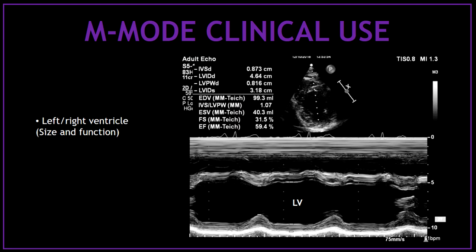You can also use the M-mode to measure the left and right ventricular size and wall thickness in diastole and systole. The most common views to do this are the parasternal long axis view and the parasternal short axis view at the papillary muscle level. By using the M-mode to measure the left ventricular size in diastole and systole, you are also estimating the ejection fraction by the Teichholz method, and therefore assessing the systolic function of the left ventricle. In this picture, I'm using the M-mode on the parasternal short axis view at the papillary muscle level to measure the diameter of the left ventricle in diastole and systole, as well as the wall thickness.